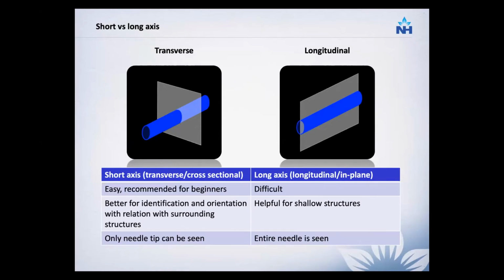So then we know that we have started from the tip of the needle. Again, we use the bevel edge up so that the bevel edge faces the ultrasound probe. In this way, the ultrasound rays get reflected and you can see a bright star-like structure, and it is very hyperdense as compared to the shaft, which is hypodense.